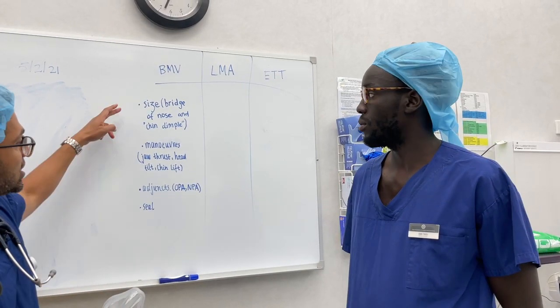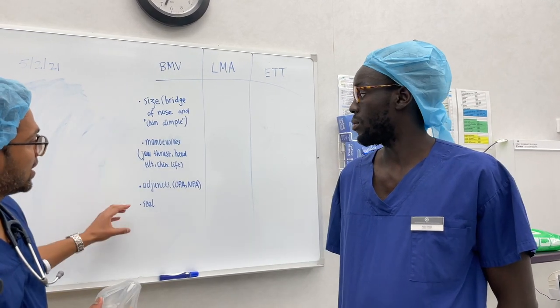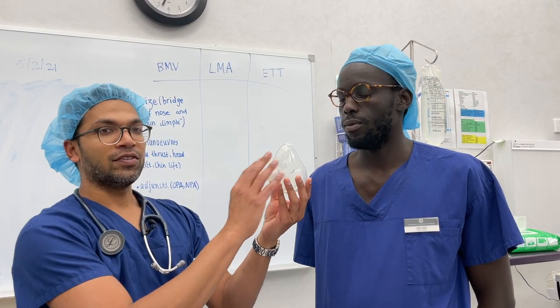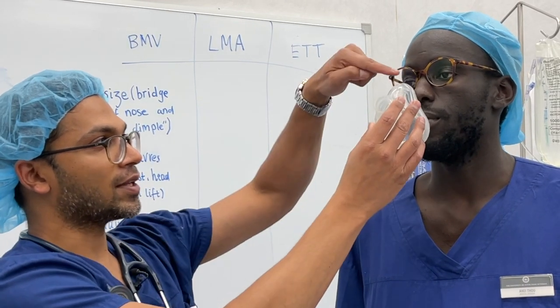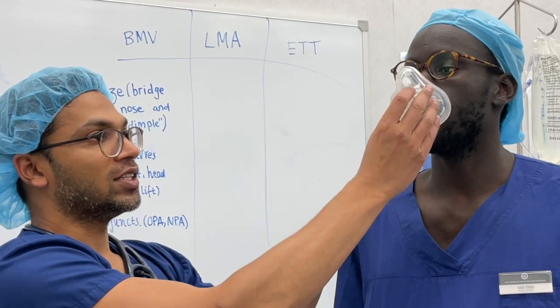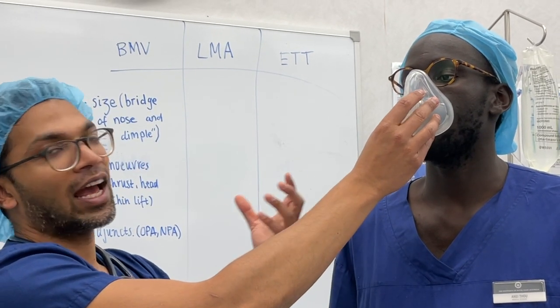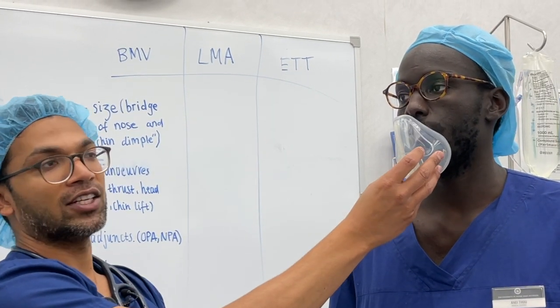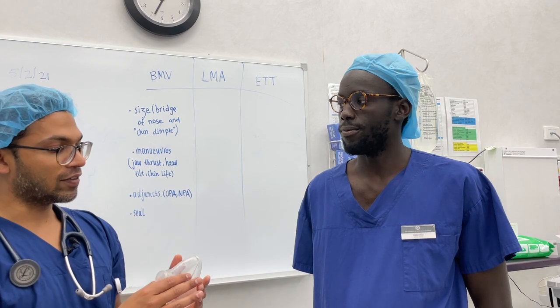The first two things that will help create a really good seal are appropriate sizing of the mask and creating a good seal. I want the mask to fit exactly perfectly around the face. The perfect landmarks are the bridge of the nose and this chin dimple here. If the mask is too big you might see it going over the edge of the chin or not properly covering the mouth. Regardless of size, these are your endpoints to create a good sealing face mask.